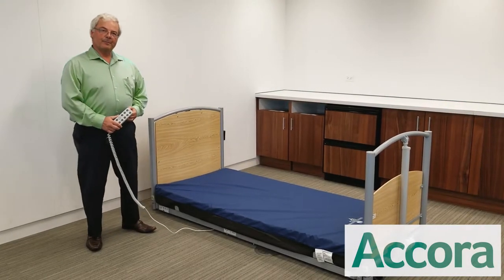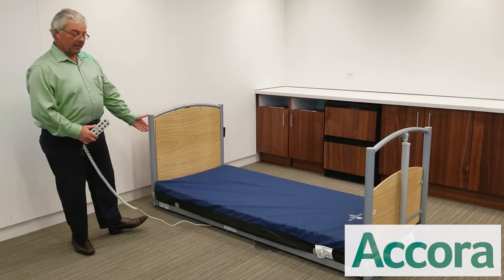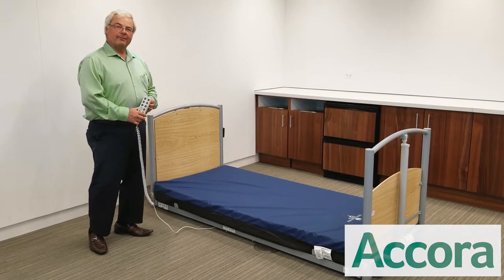Hi, I'm Steve Rankis, a registered nurse from Accora. A true bed for all — the floor bed goes to floor level to help prevent fall injury, rises to full height for standard nursing care, and is a full five-function bed.